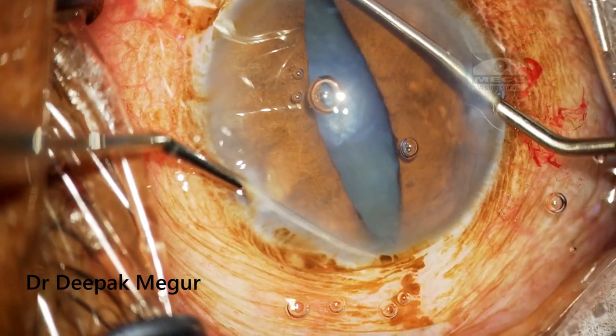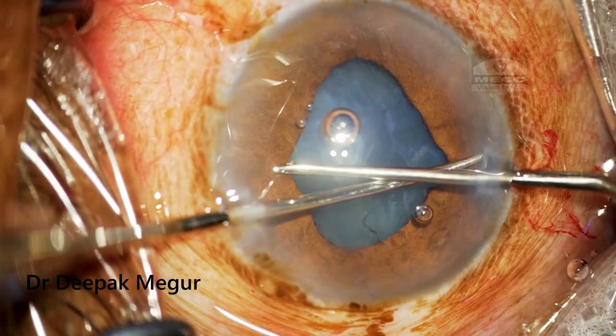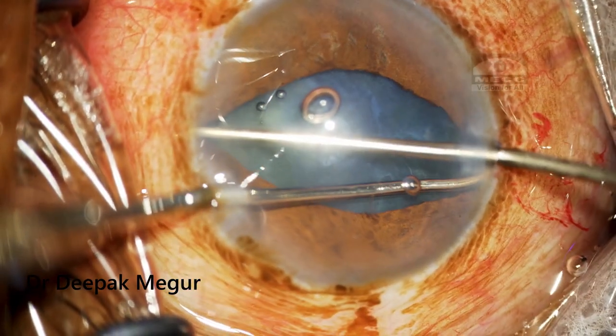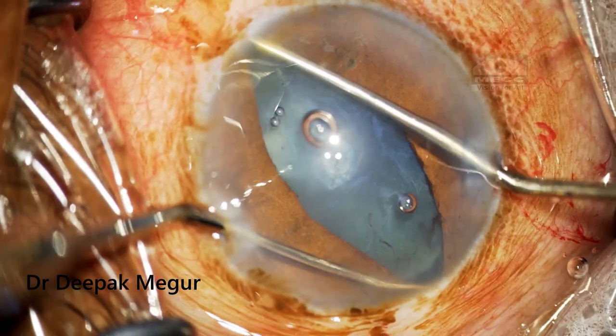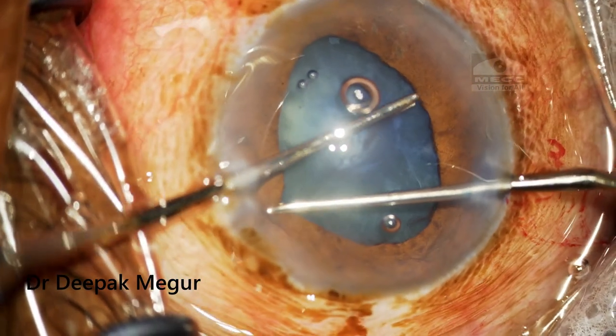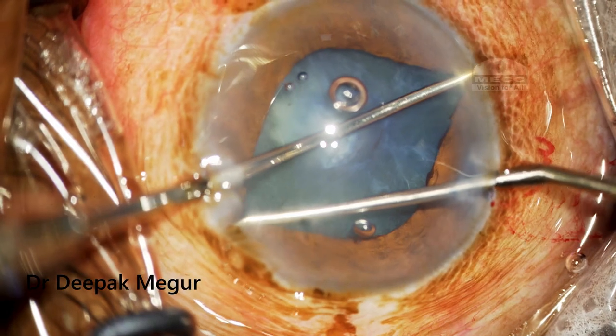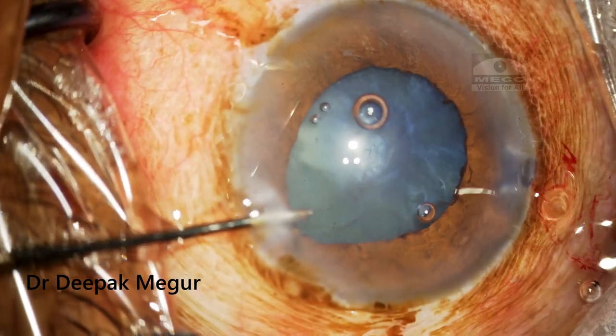I am using a Y-hook to do this maneuver — it is an excellent tool for this. I usually perform this stretch maneuver in four different planes: two vertical and two oblique. Fortunately in this case, the pupil has expanded significantly enough, so I aborted the idea of using any pupil expansion device.